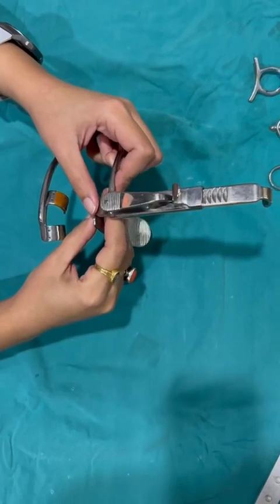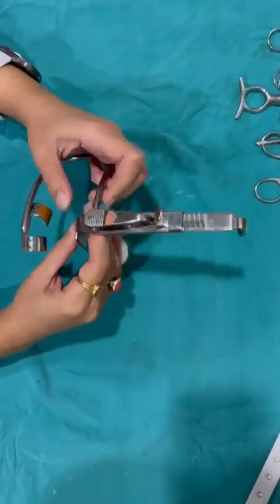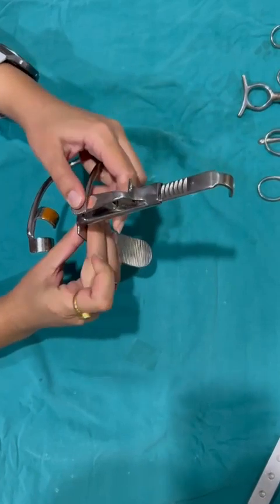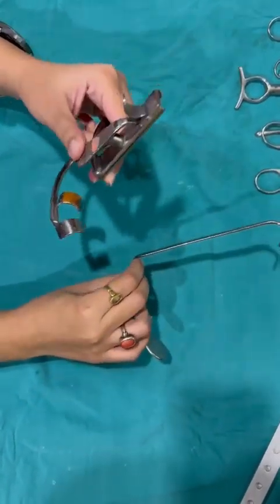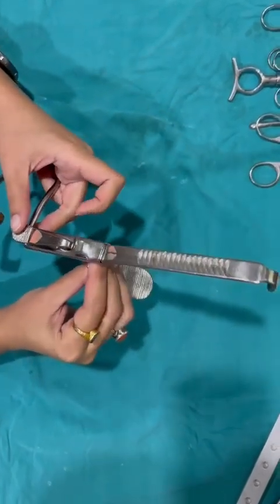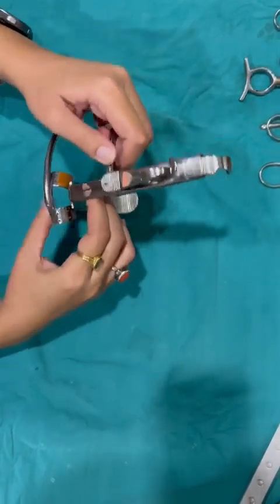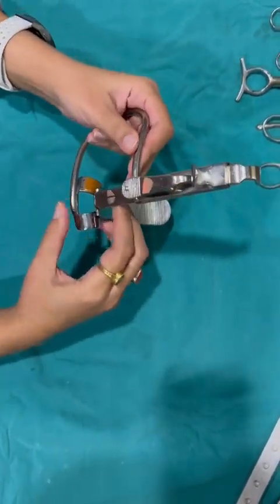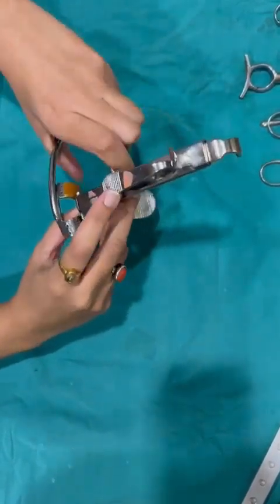Now, to begin with the instruments, first we start with the mouth gag. This is a Boyle-Davis mouth gag. The blade is known as the Boyle's blade, and this is a jaw piece which is named after the scientist Davis. This is the procedure for how you fix the blade in the mouth gag. We place it in the mouth of the patient, then we gently open it in order to open the mouth wide.